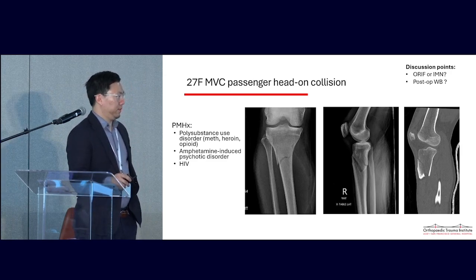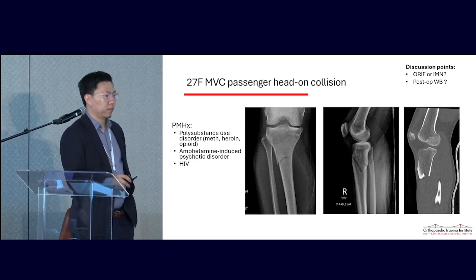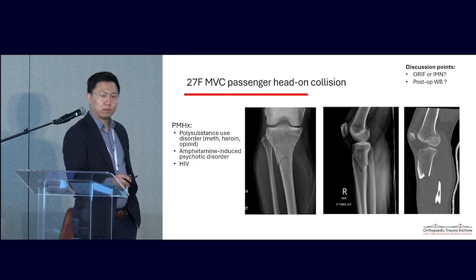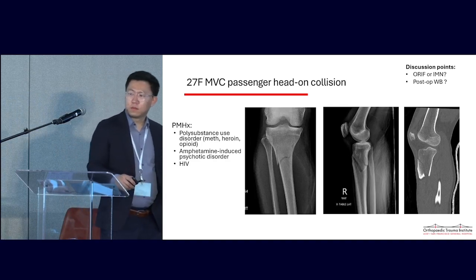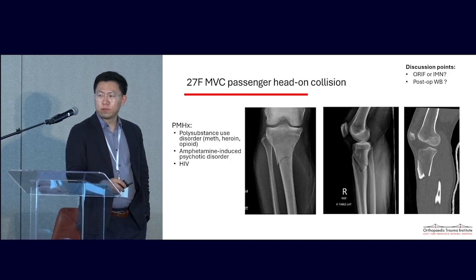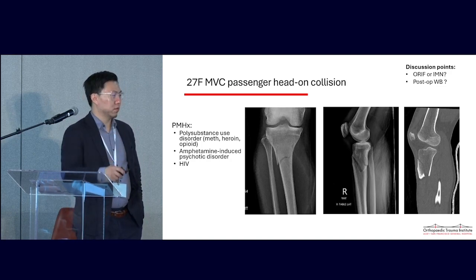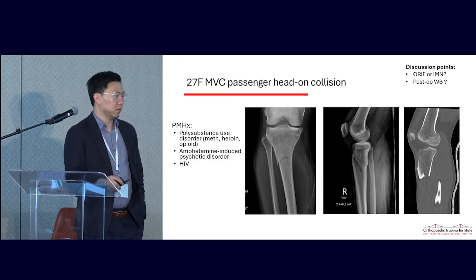I thought Paul Tornetta's semi-extended was lateral parapatellar. Yep, he did lateral, underneath the patella. Right, lateral extra-articular. He did a parapatellar as well. Yeah, I was reluctant to go through the knee too, but I tell you, when you've got no help, having the leg fully extended and doing a suprapatellar nailing makes it so much easier. This is fully extended. I don't have any problem. I just don't like going through the knee, and I don't need to.